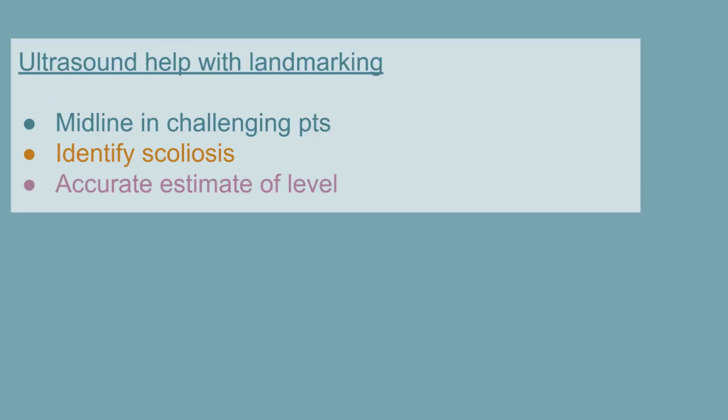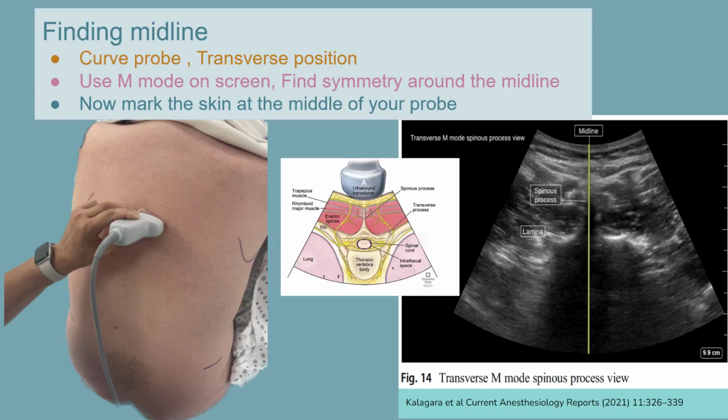How can ultrasound help with that? Ultrasound can definitely help us find the midline in challenging patients. It's a very easy first start. And if you only start with that, that already will be very helpful. So how do we find the midline with ultrasound?